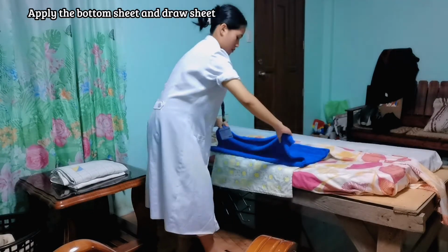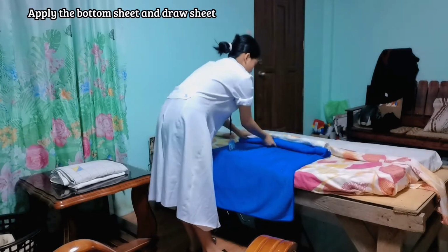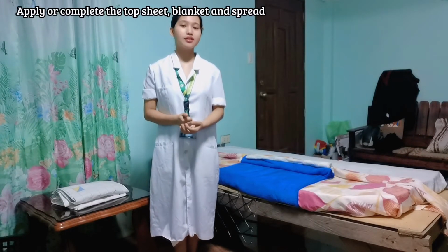And then the draw sheet. And then we're going to apply the top sheet and the blanket.